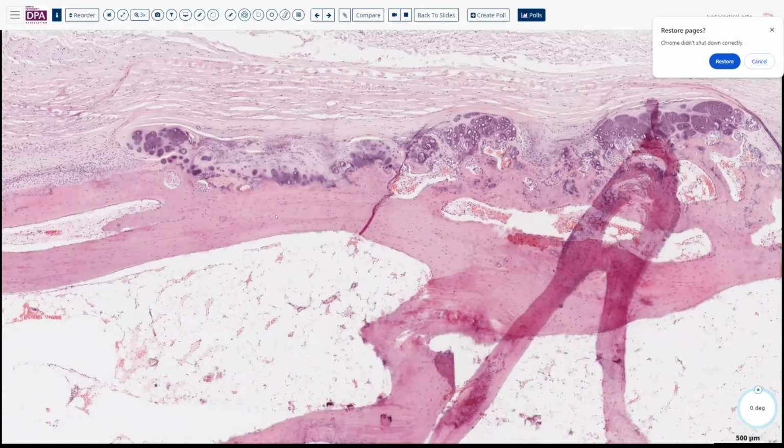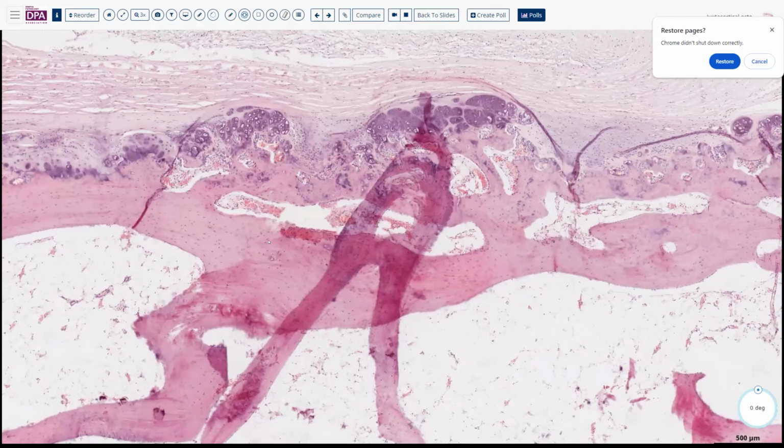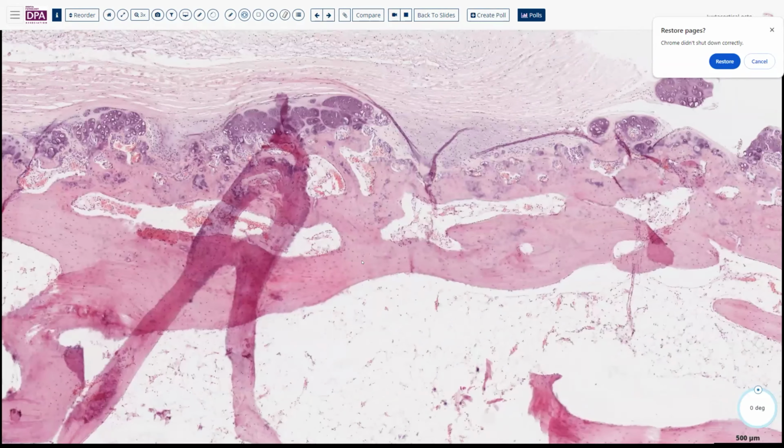The pathogenesis for this lesion is thought to be essentially just displacement of some of the growth plate cartilage tissue that gets pulled along in a localized manner as the bone grows. And then this tissue can continue to proliferate and produce bone without the same kind of growth controls that we usually see at an endochondral growth plate.